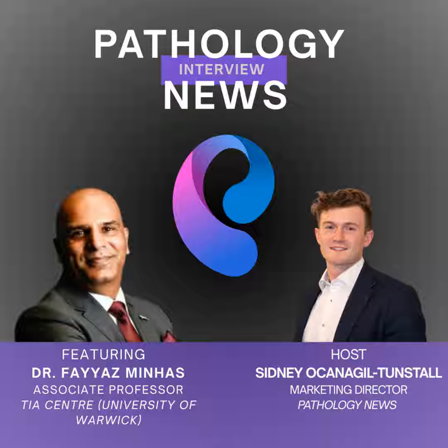And obviously, when these algorithms are put together, they're tested there and then, and we understand that that's not perhaps a true clinical environment. So what happens when they do enter a true clinical environment? I think if the goal is prediction only, and you benchmark it on a large enough set of the right population and it's giving you very good results, it's okay. But it's when you want to mine what signal in the tumor or in the tumor image is it picking up that it's using to predict, that's where the line becomes a bit blurry.